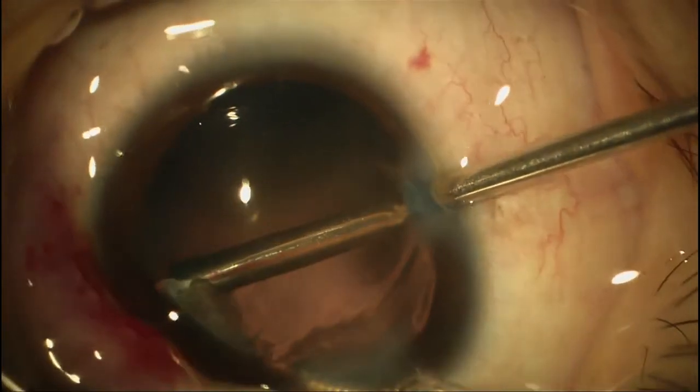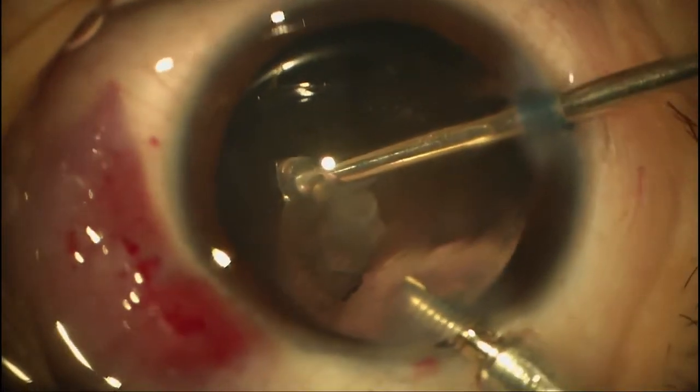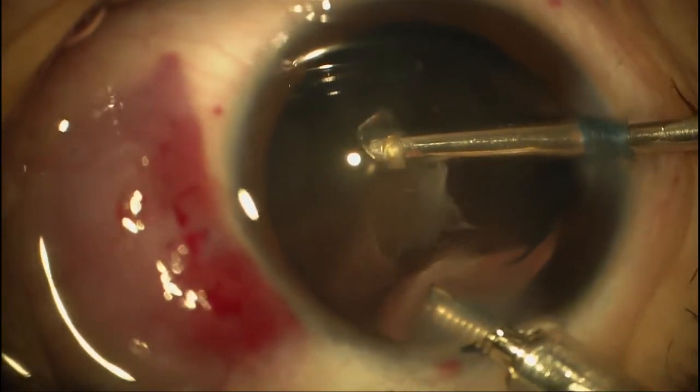We're working around that area where the capsule is out a little bit. Looks pretty good though — I don't think we have any loose radial areas. It's just elongated, but you can see how sticky that is. Look at those strands that are pulling off.